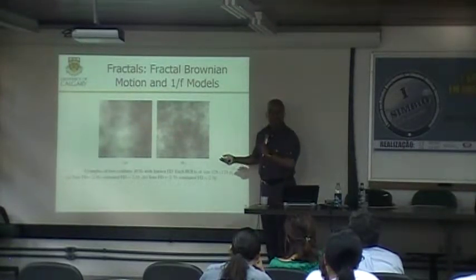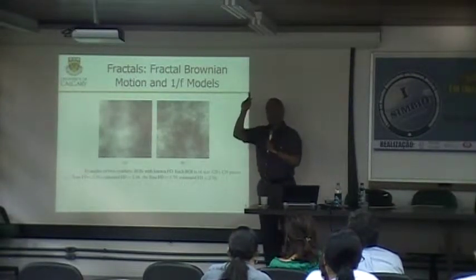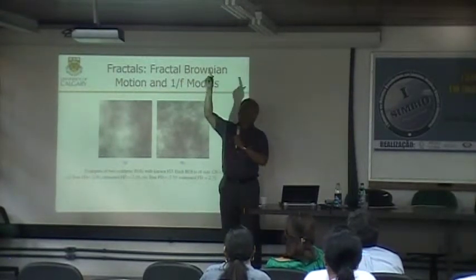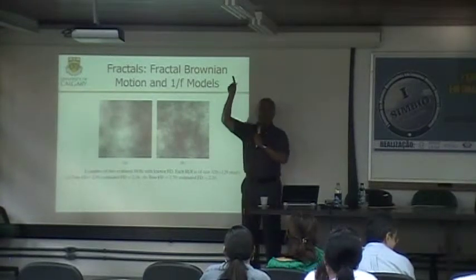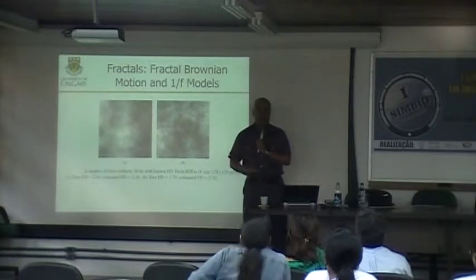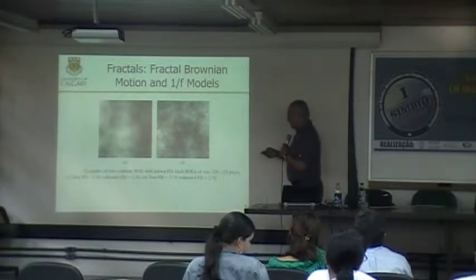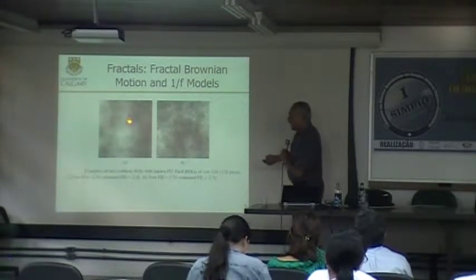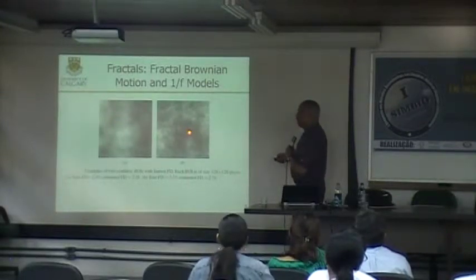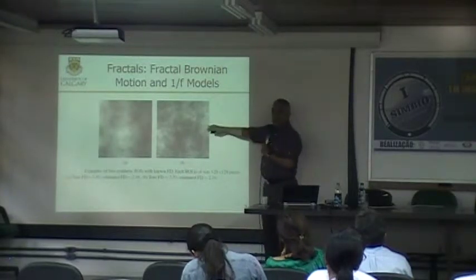They look like mammograms or clouds. Mammograms sometimes look like clouds. Clouds sometimes look like mammograms. So sometimes we have fun looking at a cloud and say, look at that, it's like a craniocaudal mammogram and there is a spiculated tumor. And children would talk about something else, animals I suppose, and if you work with cancer too long, you talk about other things. So here the fractal dimension is 2.3, this is 2.7. Higher fractal dimension means more roughness. This was synthesized.